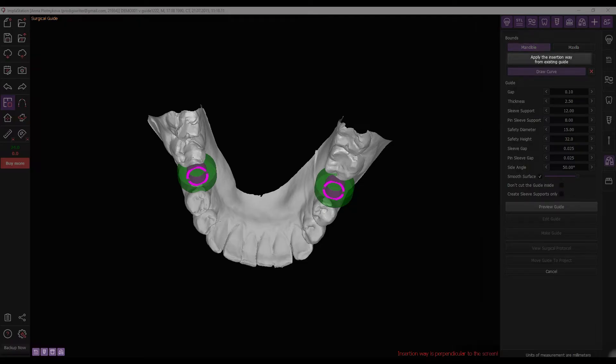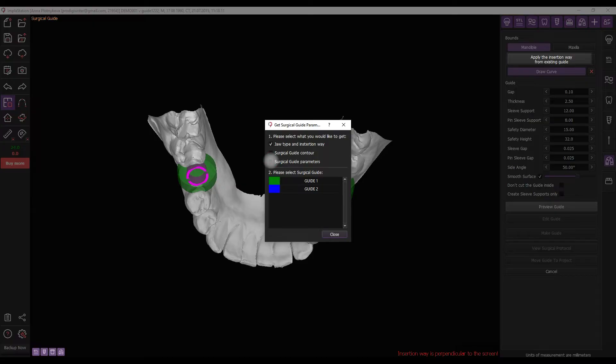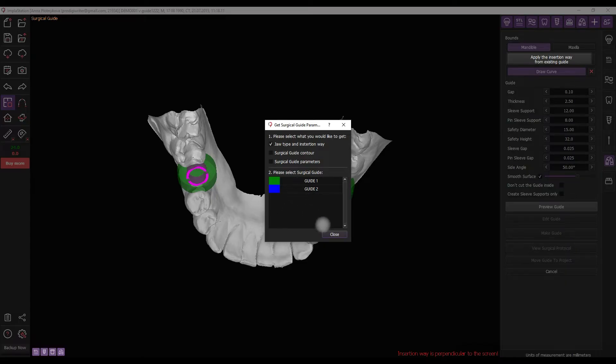Implastation offers the possibility to apply the path of insertion from existing guides. If necessary, click on the corresponding button in the menu, and in the opened window, select the parameters for the application and the required guide.